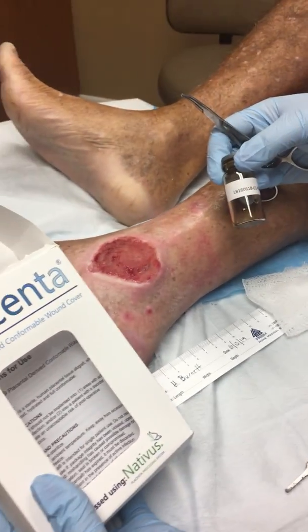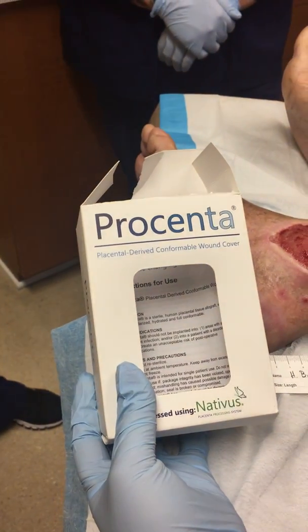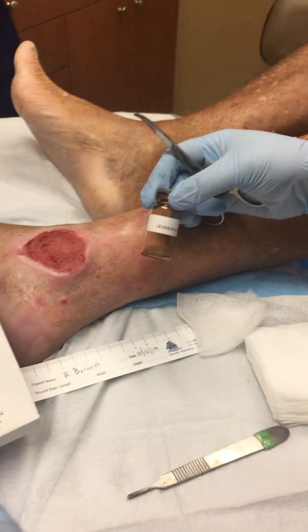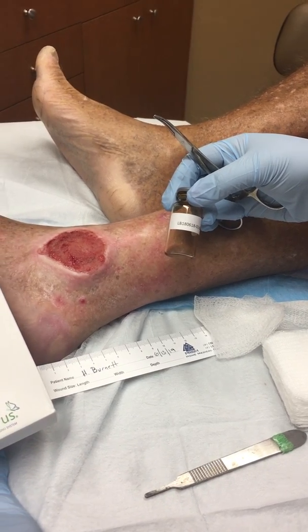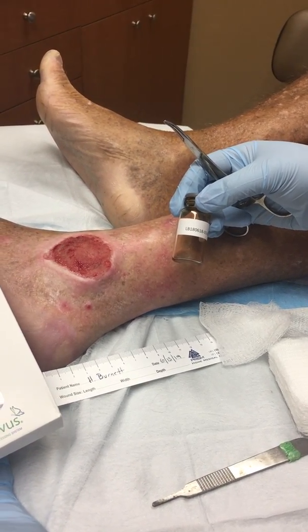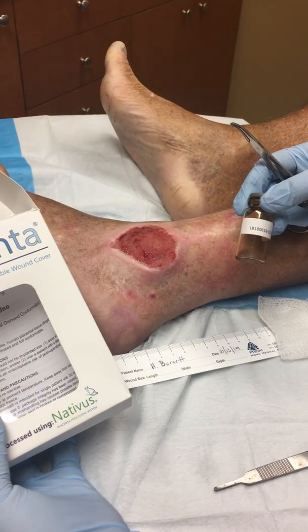This is Procenta, a placental-derived conformable 3D wound dressing, and this is the first time we are using this. The patient has had this venous stasis ulcer for close to five years now.